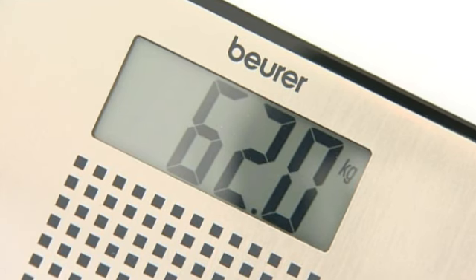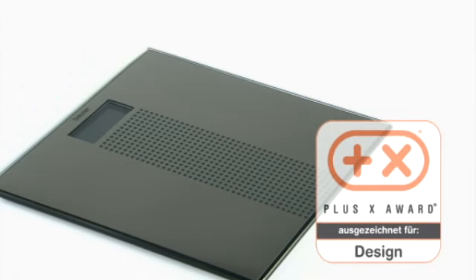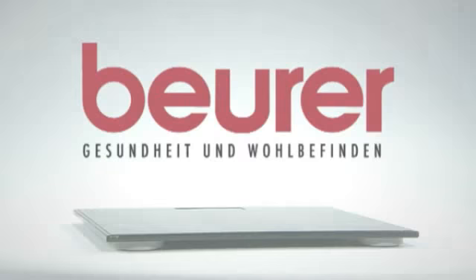The LCD display shows your weight to the nearest 100 grams. Decorated with the Plus X Award for design, the Beurer GS36 glass scale is a real eye-catcher in the modern bathroom.